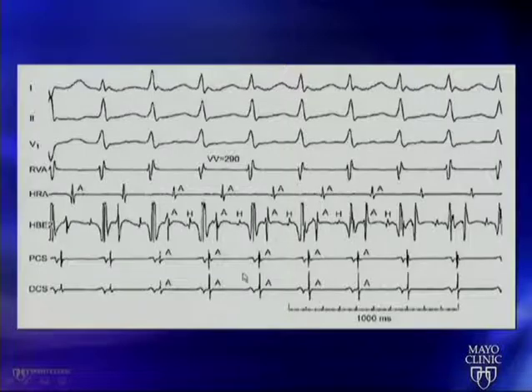So how do we recognize that? Again, start with the EKG, QRS complexes. Look at the ventricular electrogram. Then these electrograms, which don't line up with the V, they're all atrial electrograms. Now you just visually look at them and say, what's early? Which place activated first in the atrium? Is it the right atrium? No, because that's even later than near the AV node, the His bundle atrial electrogram.